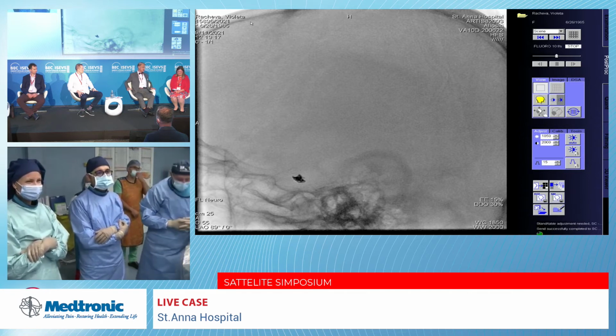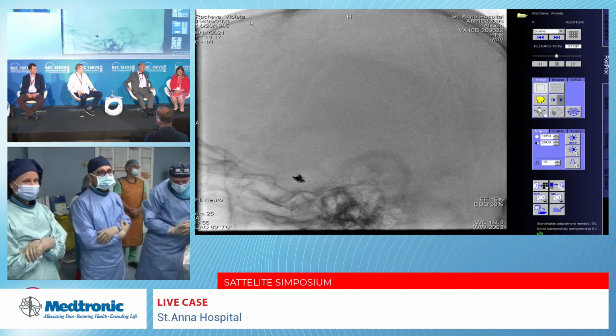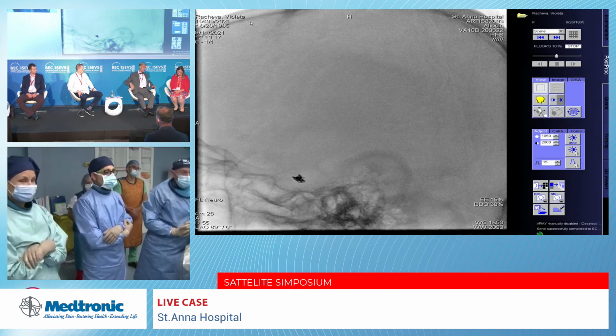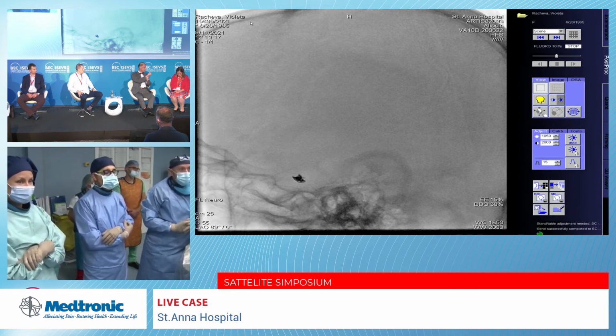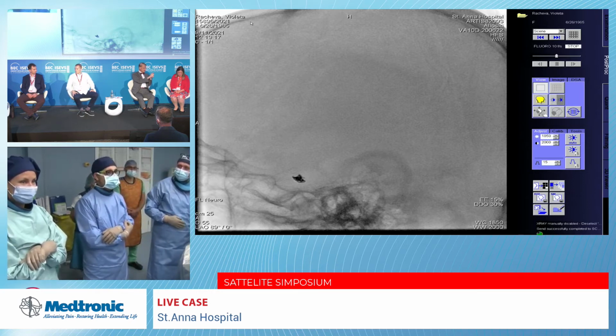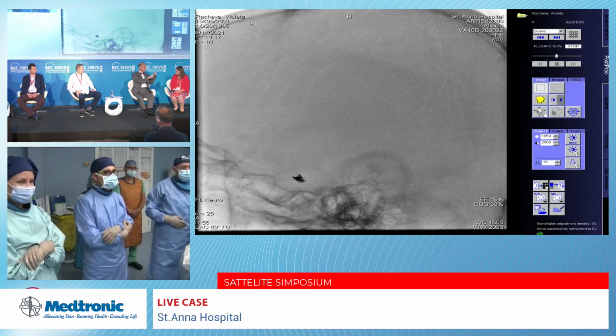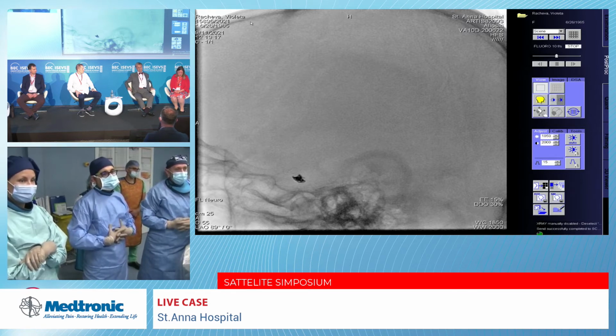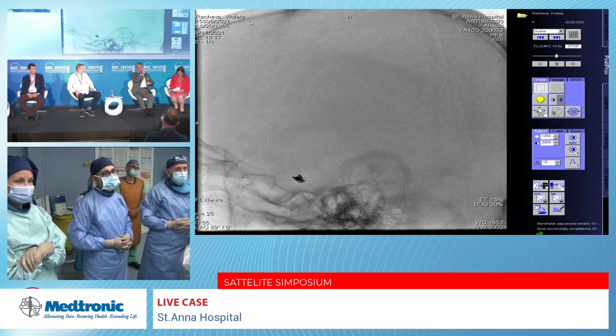And when you work with a flow diverter or stent, you also have 2 options. You first place the stent and go through the meshes and coil, or you go with 2 systems: place the tip of your coiling microcatheter in the aneurysm sac, then with the second system place a stent, and then you can coil, and at the end you pull out the microcatheter. So there are different options, depending on the size and shape of the aneurysm and the size of the neck.